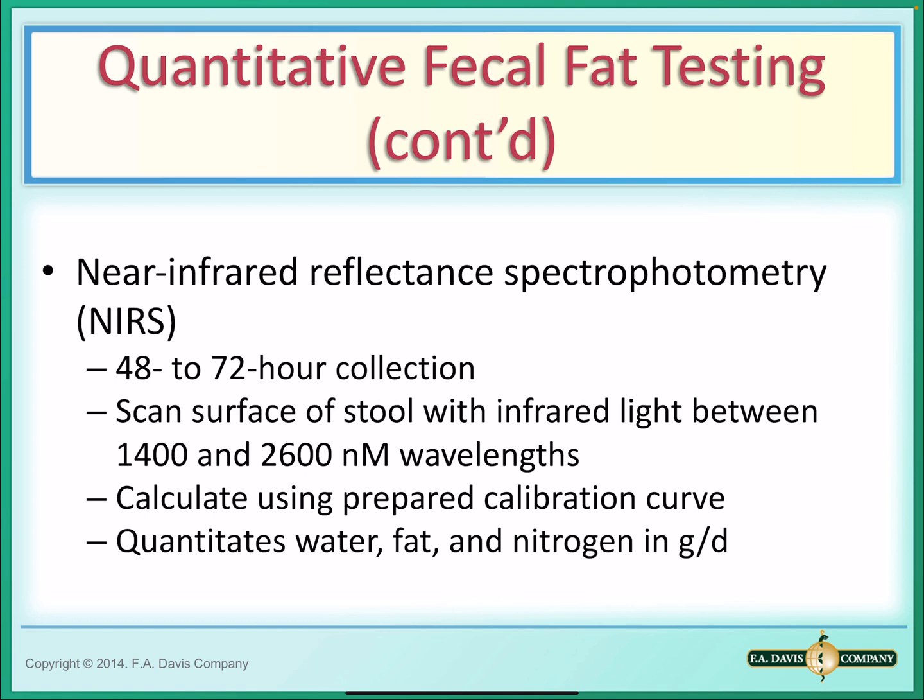NIRS stands for Near Infrared Reflectance Spectrophotometry. This is a rapid procedure for fecal fat that requires less stool handling by the professional laboratory personnel. The test requires a 48 to 72 hour collection of the stool to exclude day-to-day variability, but it does not require reagents after homogenization of the sample.